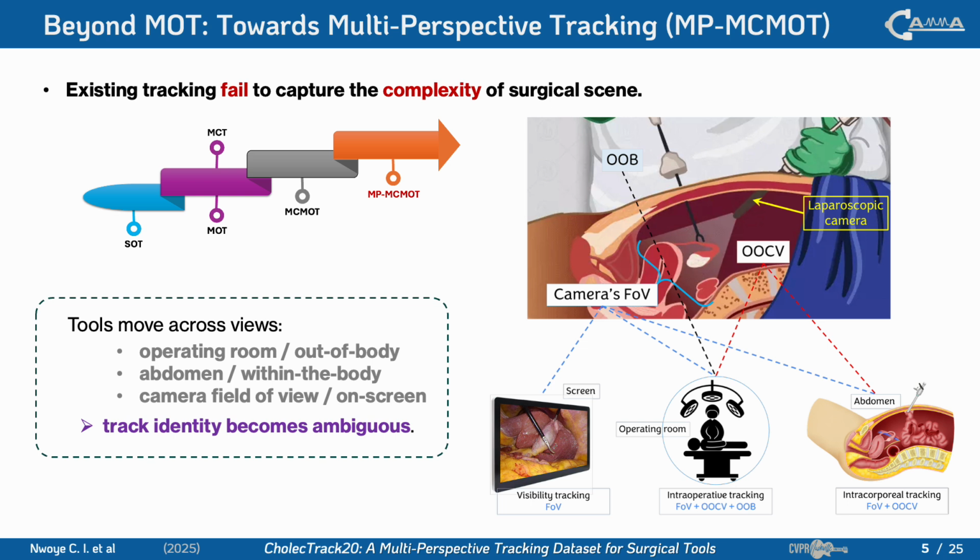Conventional paradigms such as single-object tracking, SOT, or multi-object tracking, MOT, fall short in surgical environments. They struggle with persistent occlusion, tool reappearance, and viewpoint changes. A tool exiting the body or camera view may be wrongly assigned a new identity, breaking temporal consistency.